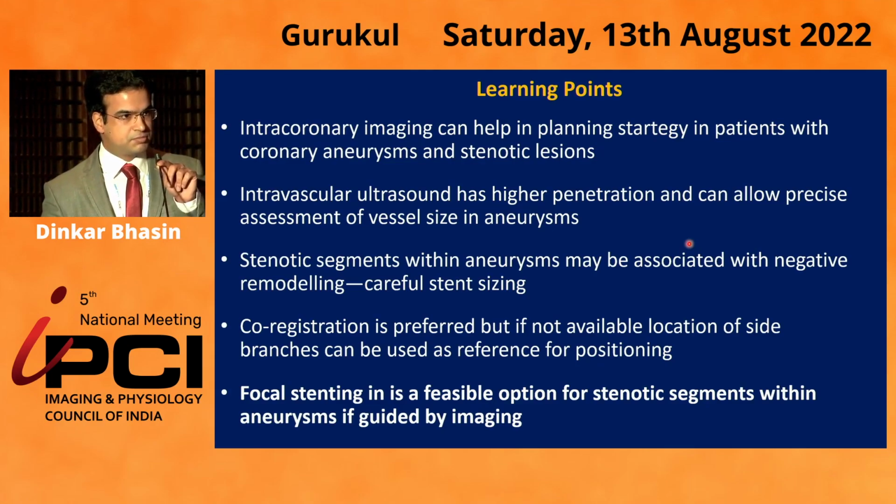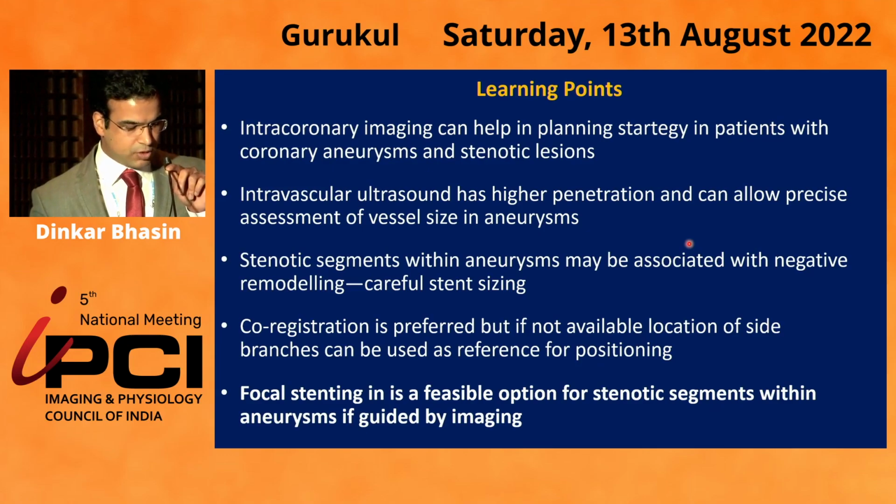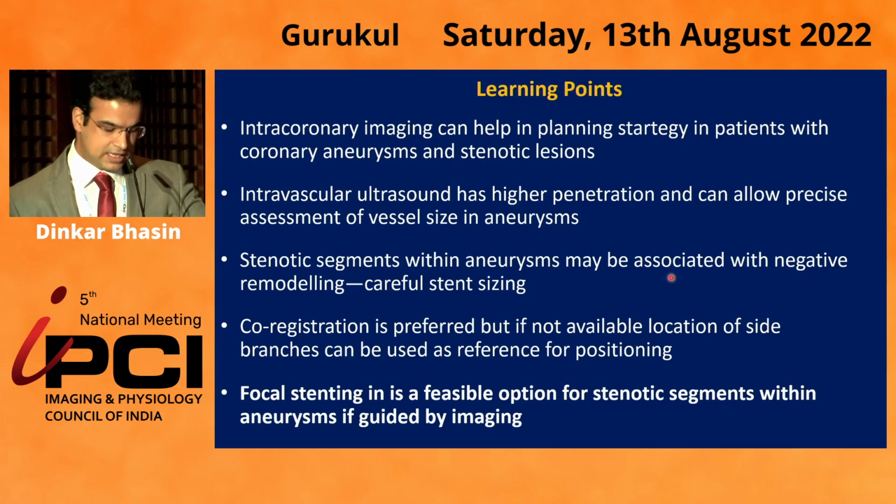And co-registration is preferred, but is not easily available. We can use side branches like we used the diagonal side branch here. And the last point is that focal stenting is a feasible option for stenotic segments if guided by imaging.